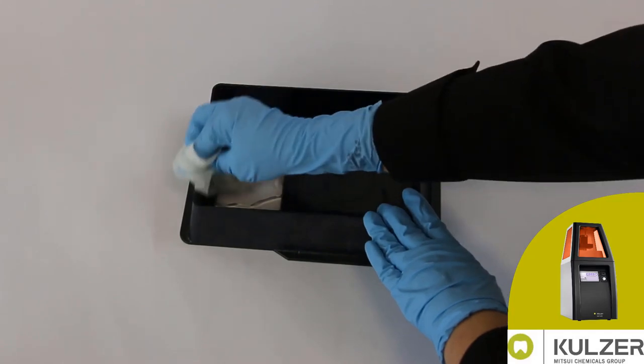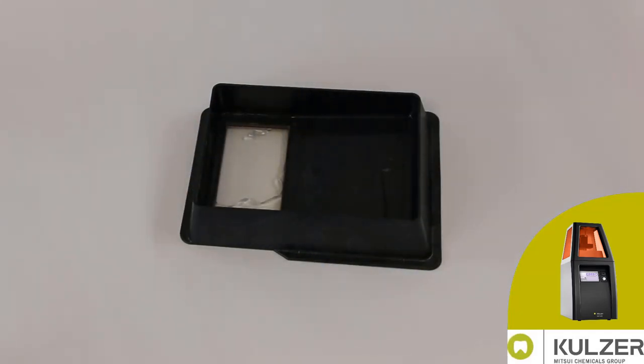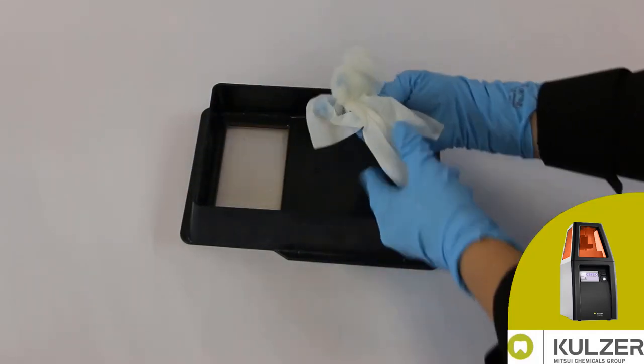Now material residues can be removed from the surface of the resin tray with the isopropanol using a soft wood-free paper towel.